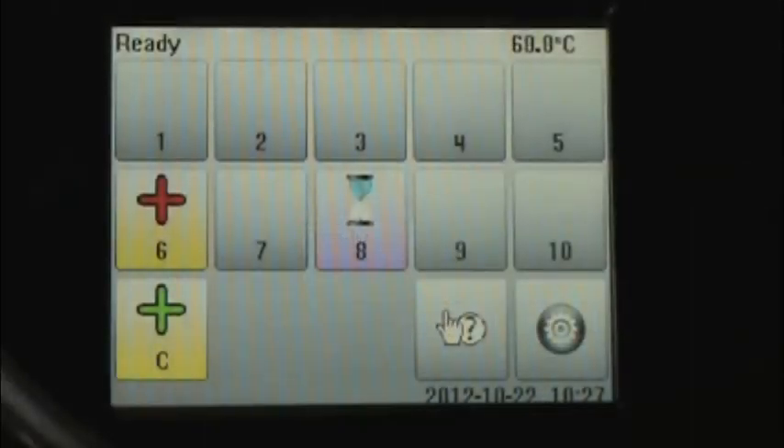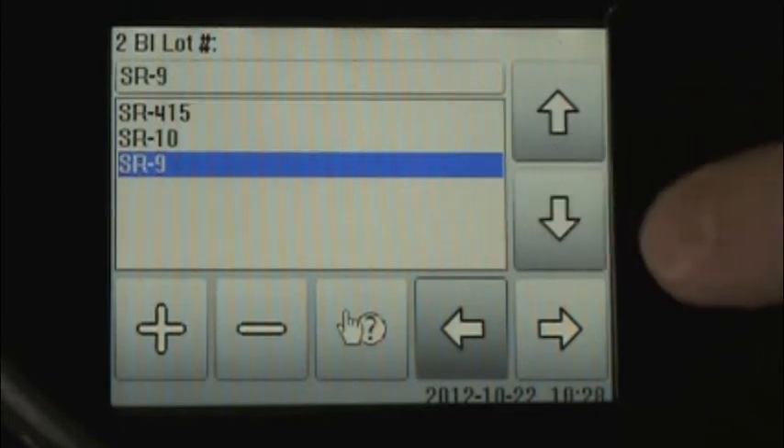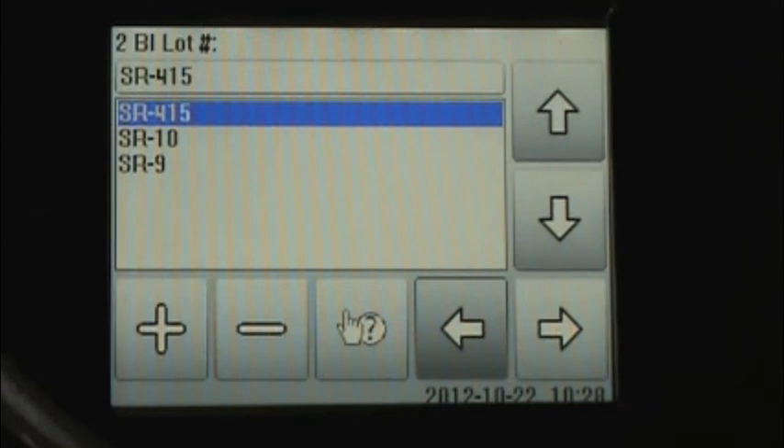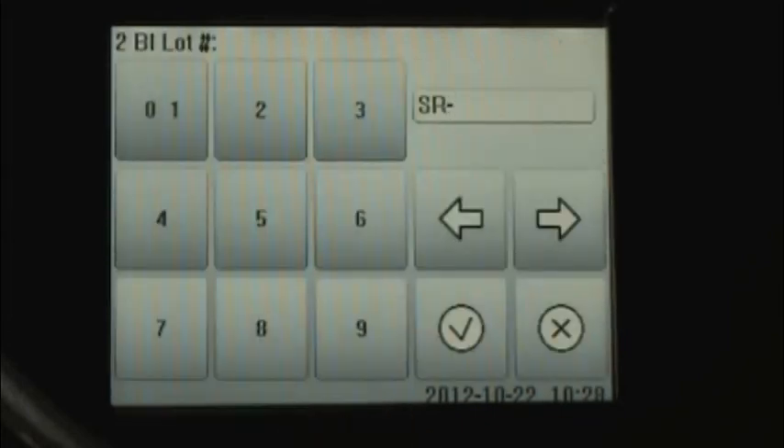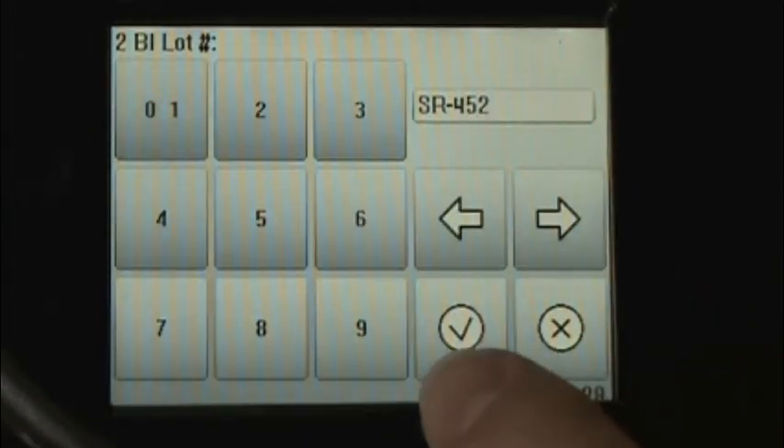When a BI is inserted into the incubator, the BI Insert Wizard will automatically come up and walks you through the information that's necessary to add to the incubator. The first thing that comes up is the BI lot number, and the incubator will remember the last few lot numbers that we've used. So if they appear on the list, we can simply select the appropriate lot number and move forward. If you're using a new lot number that is not pre-populated, we press the Add button. We can then enter the three-digit lot number and click the check mark.